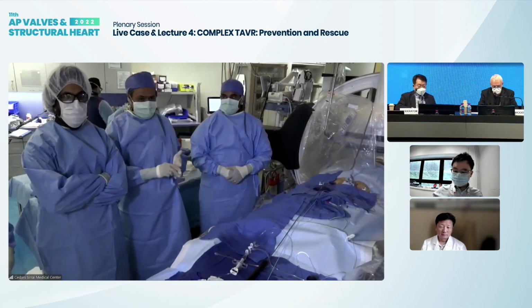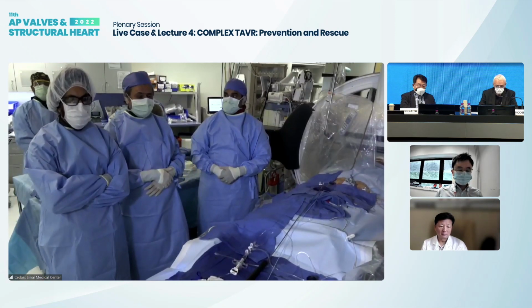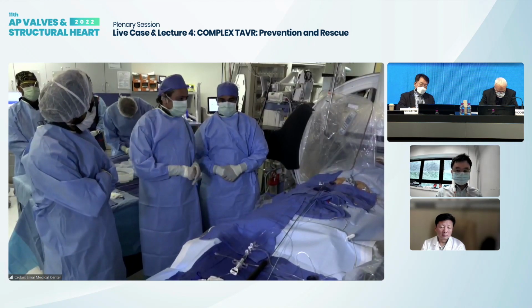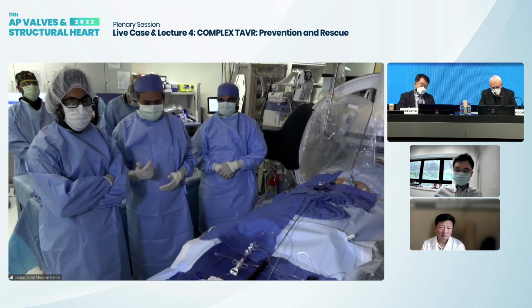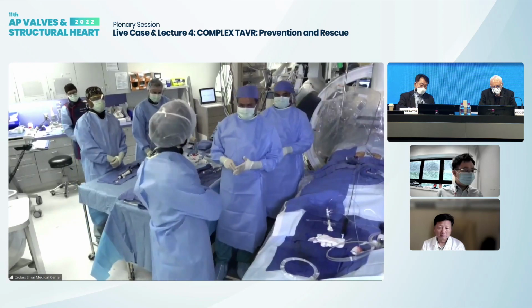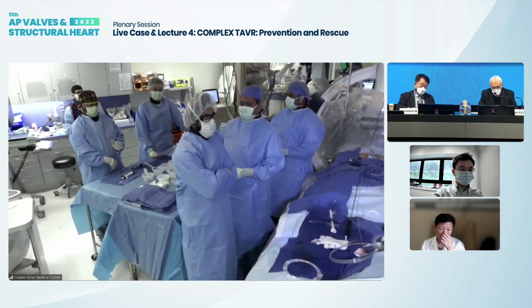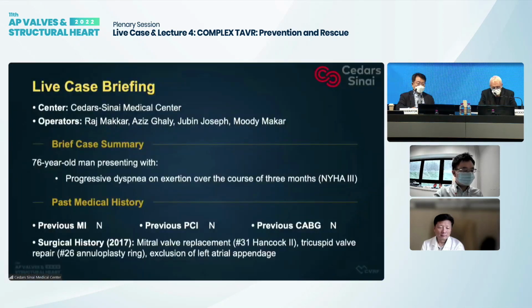So it's a pleasure now to show you another case, and we thought we would show you a case of mitral valve in valve. Once again, to my left is Jubin Joseph, who's our stellar senior interventional fellow, a very gifted person from Oxford, Cambridge, and all the good places. To my right is Sean Gogia, who's our interventional fellow, advanced structural. Then we should have Dr. Gali joining us soon. We have Dr. Moody Makar, who's doing anesthesia. Dr. Singh is also here. And then, of course, we have Kelly, Adrian, and Eileen supporting us. So let's go ahead. Sean, please go ahead and present the case.